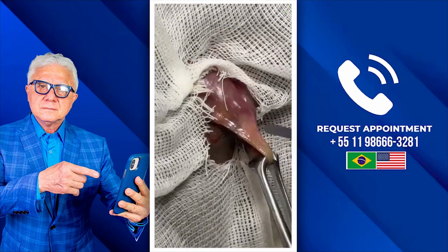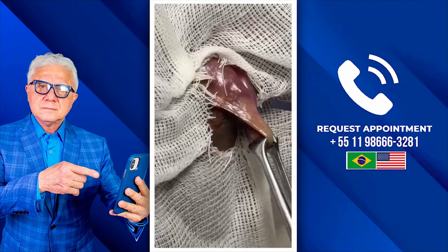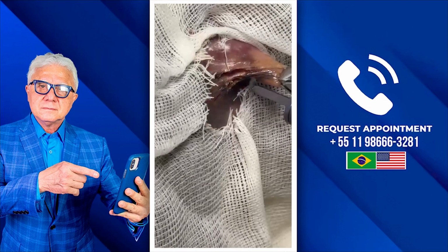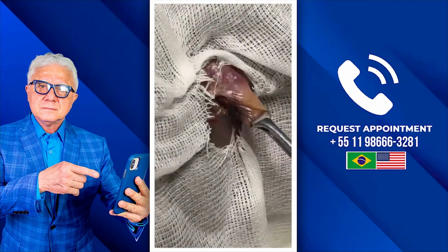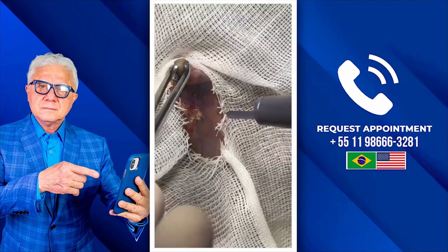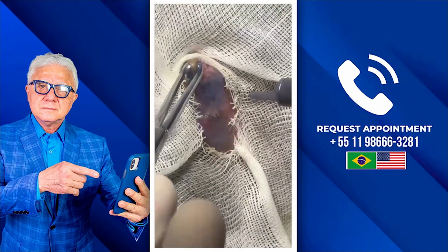Now look here. I'm going to remove this hemorrhoid with the laser. Here, look. See? There is already the internal sphincter muscle of the anus. There is the internal sphincter muscle of the anus. And here is the hemorrhoidal vessel.